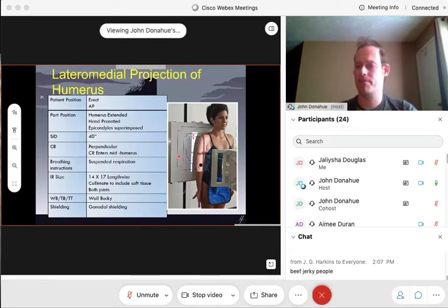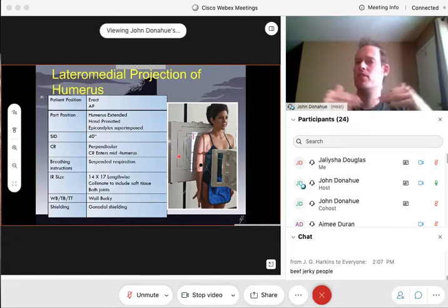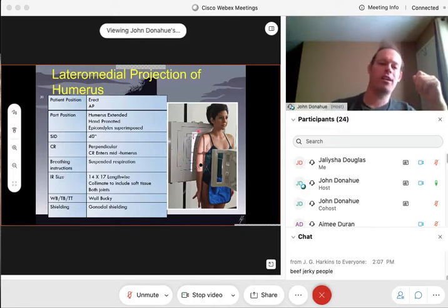Humerus x-rays do come in quite often. The easiest way to get those x-rays is the AP I just showed you and the lateral done just like this. You will see multiple methods demonstrated by text, but in my experience that's the easiest method for getting a nice true lateral of that humerus. Just make sure you collimate well and you're not clipping those joints — you need both joints demonstrated just like the AP. And your marker goes in the exact same spot for both projections, right by the shoulder in your light field so you're not clipping it off when you collimate.